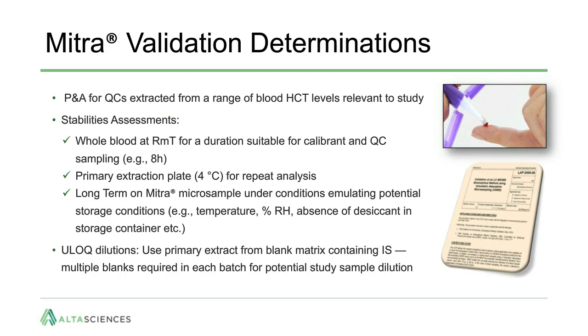As an example, I will discuss the implementation of Mitra, volumetric absorptive microsampling, in our laboratory. The potential of the device in supporting pediatric studies, home sampling for adherence, and therapeutic drug monitoring and enriching data sets was recognized. Our initial focus was for small molecules. We evaluated against a plasma method validation in terms of documentation, workflows, and experiments. For clinical validation, precision and accuracy was also assessed for QCs extracted with blood hematocrit levels at minimum and max levels relevant to the study.